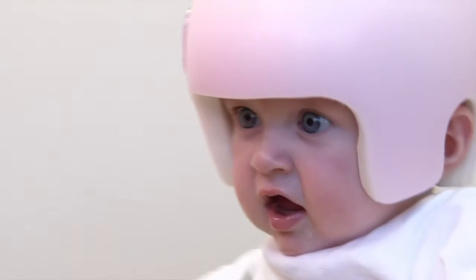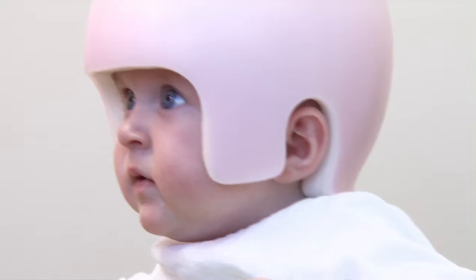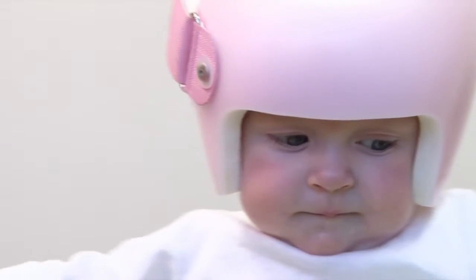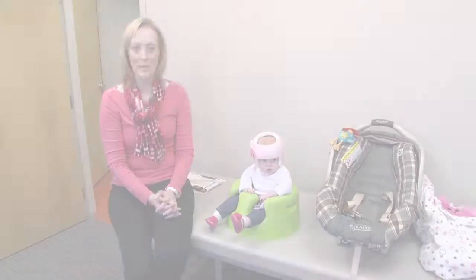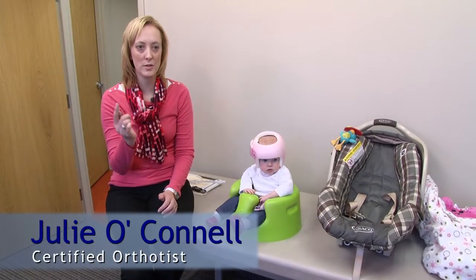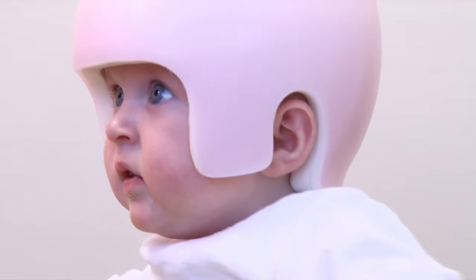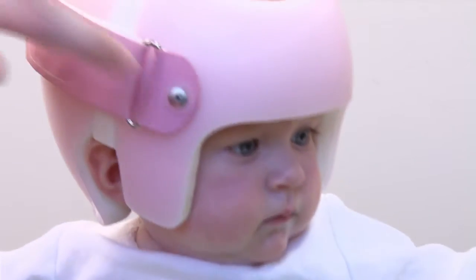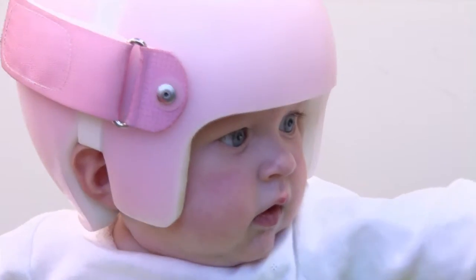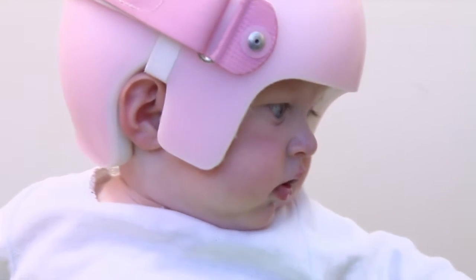You want to line up the helmet so that there's just a little bit of space around both ears. Just a tiny bit of space around each ear, so that the helmet sits just above the brow line. It's really important to take that 360-degree view of her head to look at the placement of her ears, make sure there's space around both ears, and that the front trim line fits right above her brow line and is not compressing on top of or around her eyes.